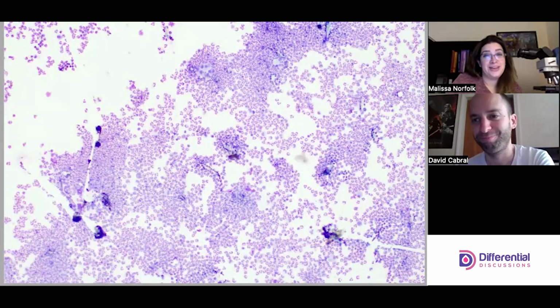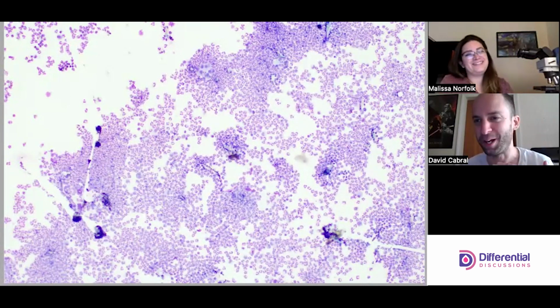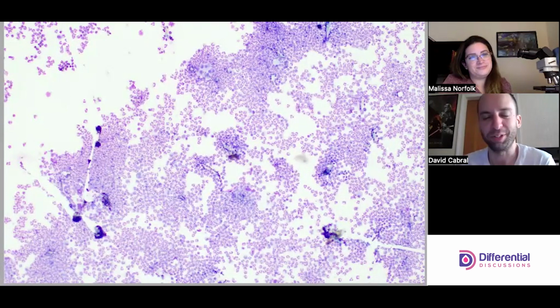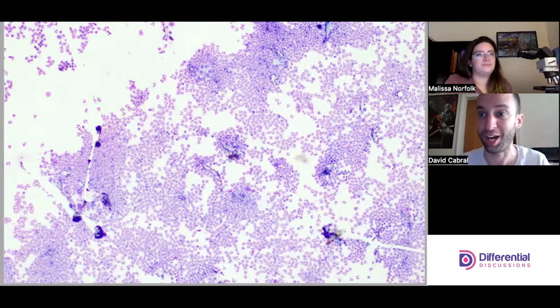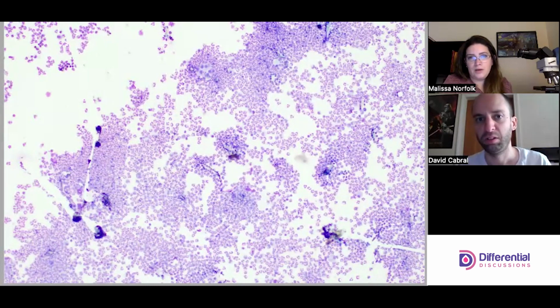And we're back looking at something brand new today. This is a really exciting departure from our normal hematology stuff. Where Melissa and I grew up as techs, we did body fluid differentials and body fluid cell counts and things like that. And there's not a lot of resources for this, right? Well, we figured we'd dive in and explore this. People have been asking for body fluids, so here we are. If there's a need for it, why not?